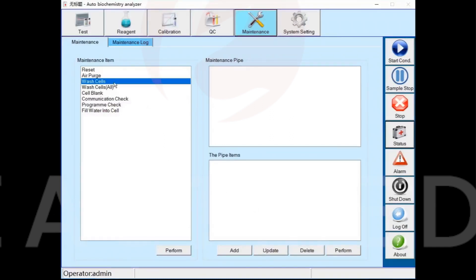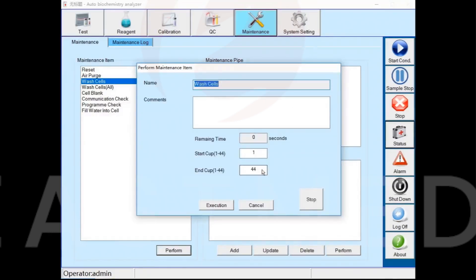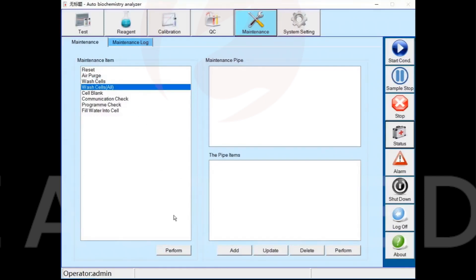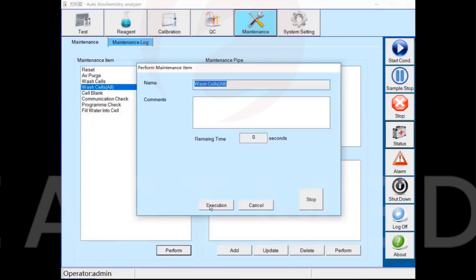Perform the wash cells function and the instrument will clean the specified cuvettes. Perform the wash all cells function and the instrument will clean all the cuvettes. Perform the wash cells all function before shutting down the machine every day.